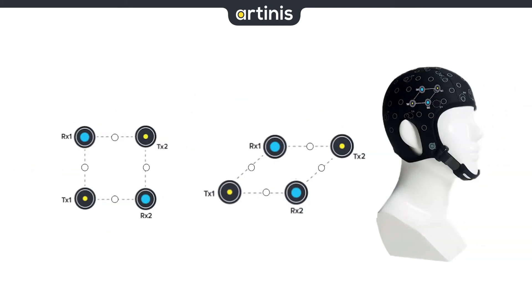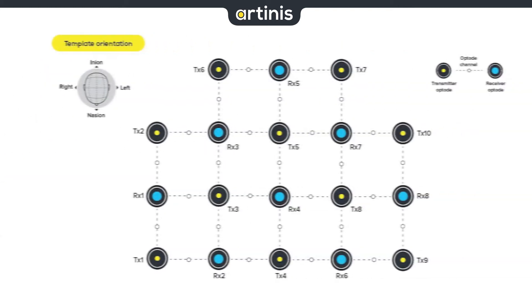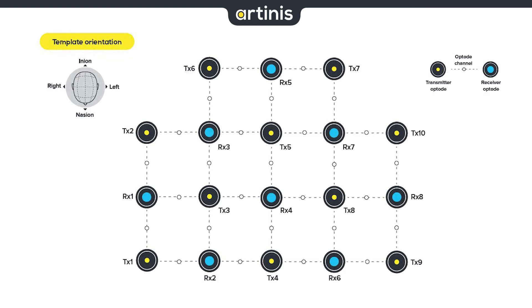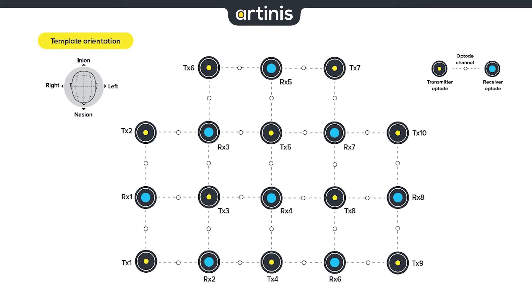The graphic representation in the manual and oxysoft will be translated onto the cap. Since this is a two-dimensional template placed over a three-dimensional head, it might appear as if discrepancies occur, but this is due to the default 30mm between transmitter and receiver. If we interconnect all 10 transmitters and 8 receivers of the Brite system, we can create up to 27 channels.